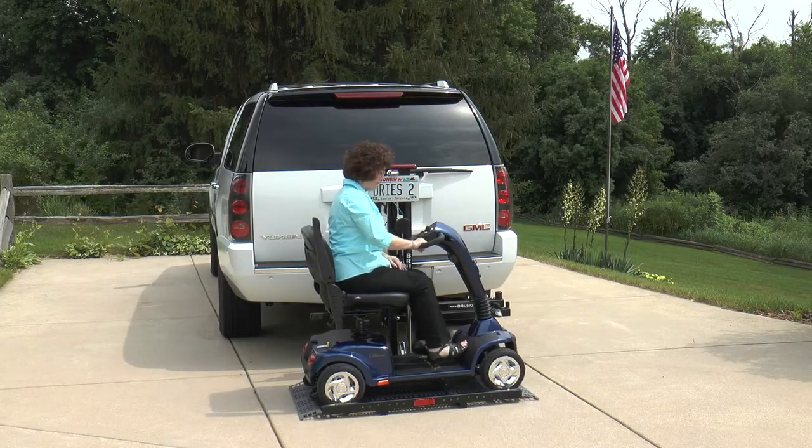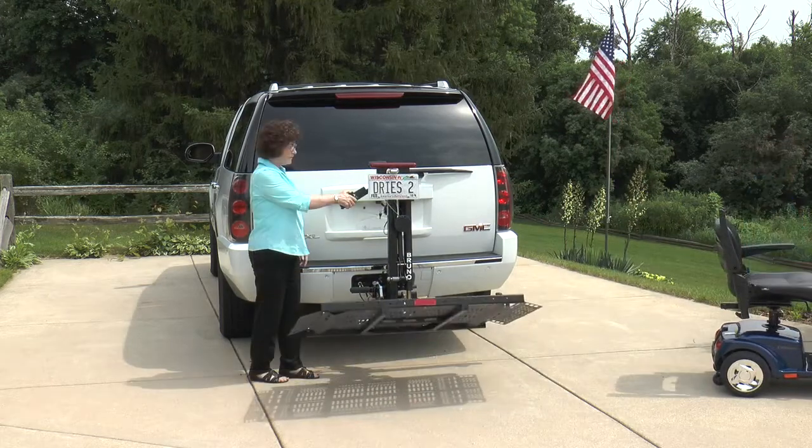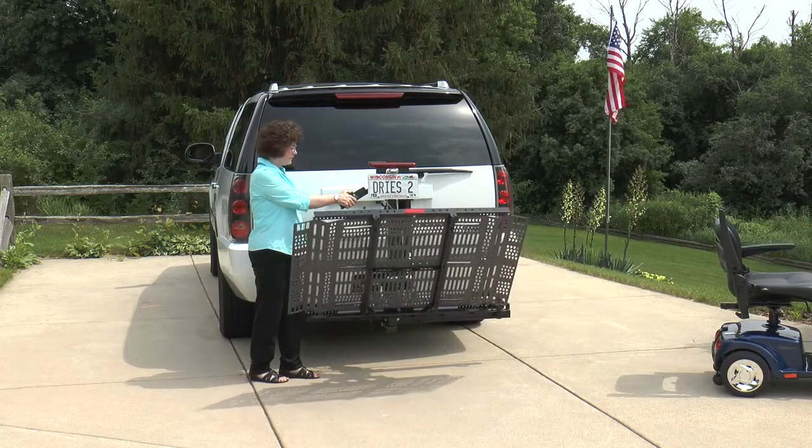No modifications are needed to your scooter or power chair to use the Outsider. And when the lift isn't in use, the platform automatically folds to take up minimum space.